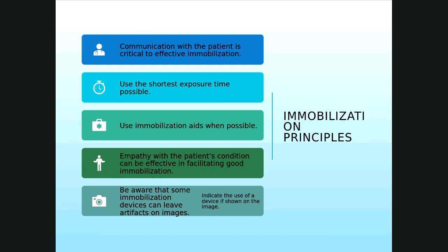You always want to use the shortest exposure time possible to minimize the chance of distortion or motion, meaning if you can achieve the image using less time factor, then that helps the patient reduce the chance of them actually moving for the exam. We are always encouraged to use immobilization aids if possible.